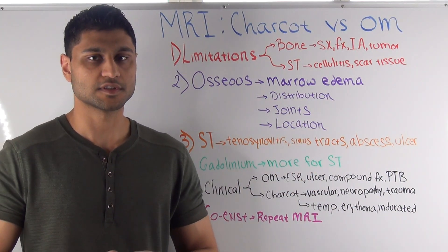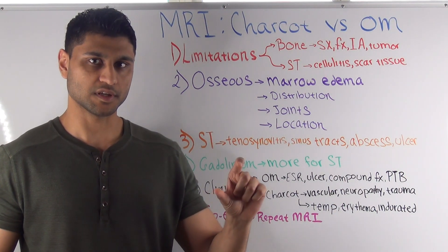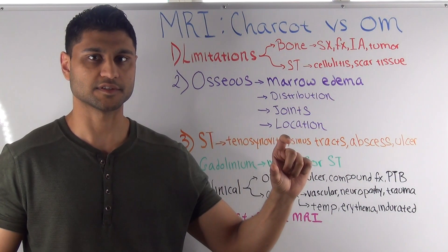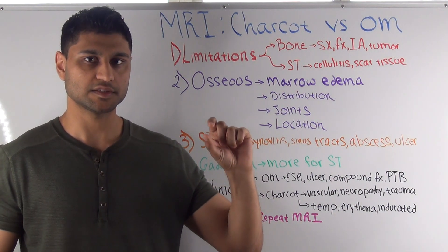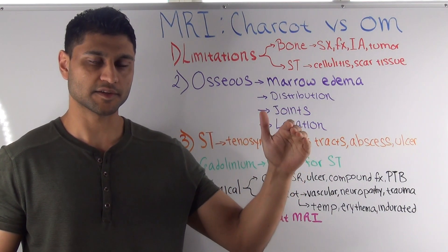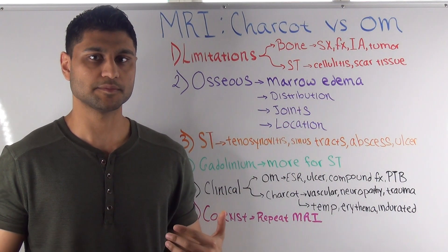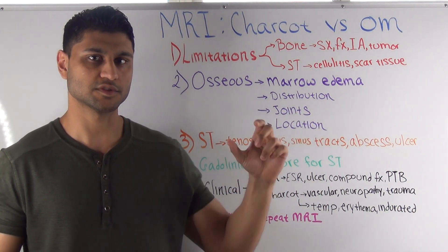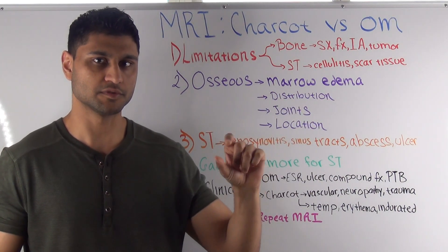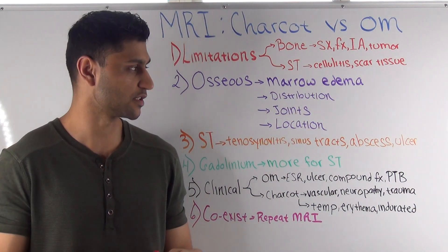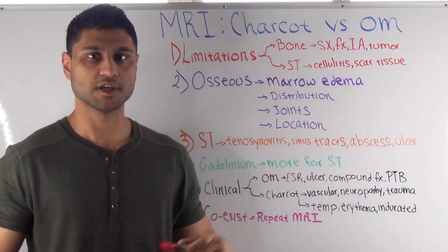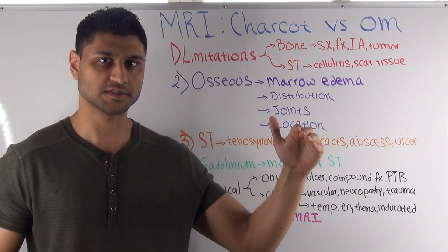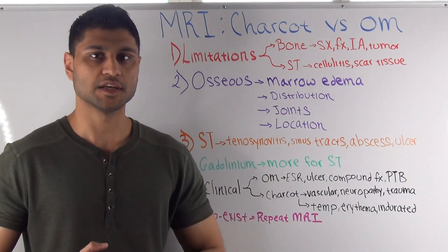In terms of distribution, for osteomyelitis the distribution will really be predominantly on one side of the joint. Going back to the first metatarsophalangeal joint — if you have osteomyelitis at the base of the proximal phalanx spreading into the metatarsal head, you'll see the majority of the proximal phalanx lit up, with only a portion of the metatarsal head showing abnormal signal. So in osteomyelitis, you see more predominance of bone marrow edema on one side of the joint versus the other. In Charcot, by contrast, you can see symmetrical subchondral edema — the same level of edema between the base of the proximal phalanx and the head of the metatarsal.